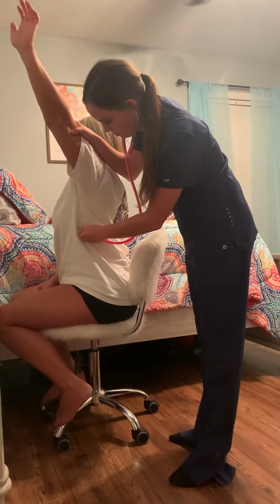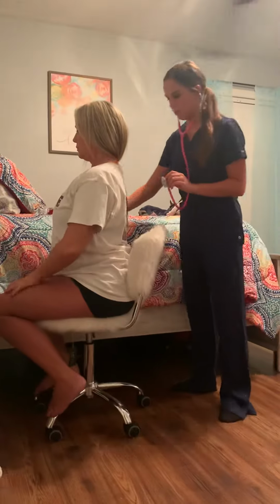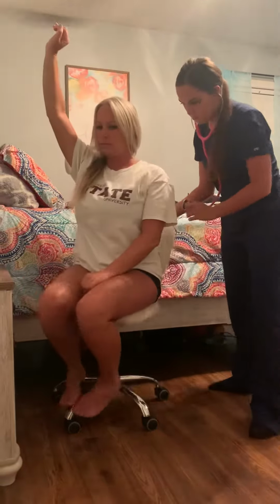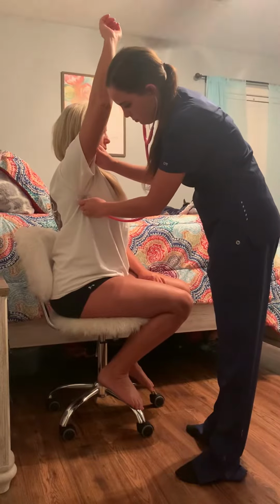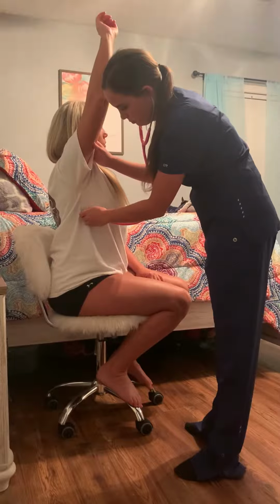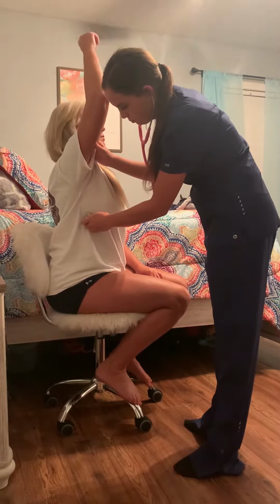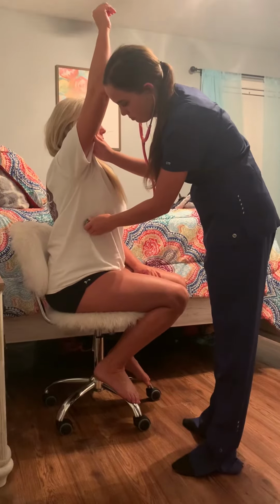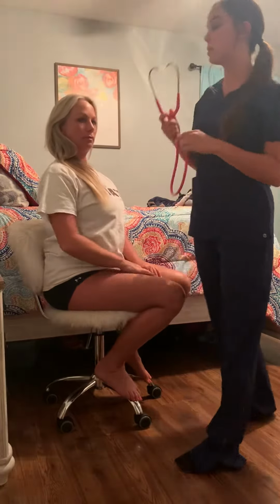Breathe in. And 4 points on the right. Breathe in. And breathe out. And she has normal breath sounds.